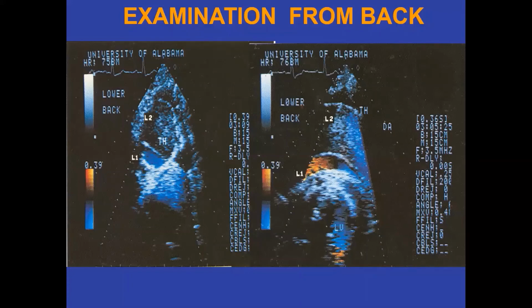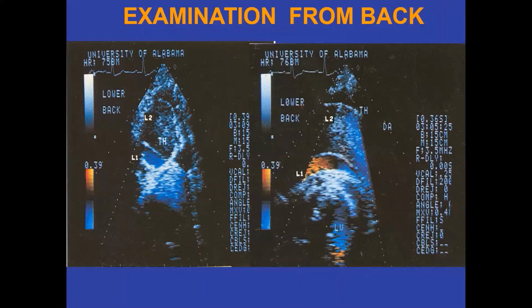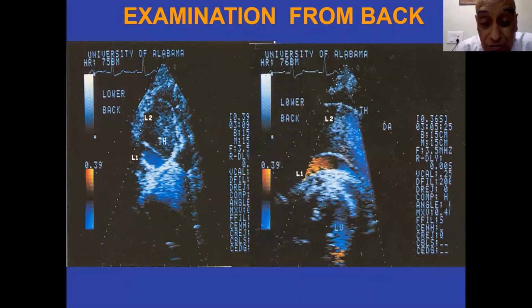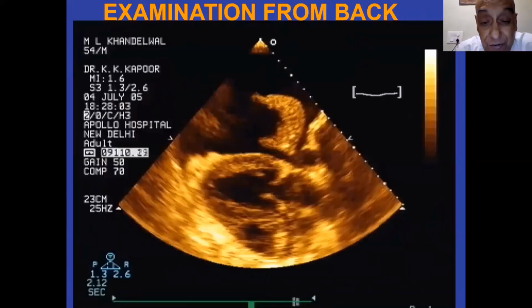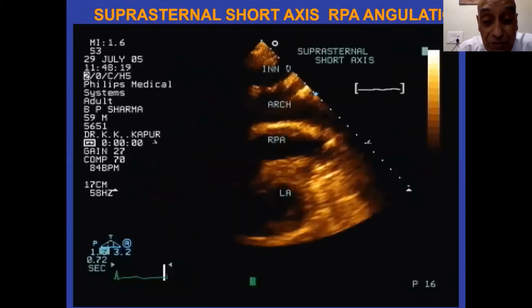Yeah. So when you're doing the parasternal long axis view, do you want me to show the image also, or you want me to just speak? You could do that, sir. People can see the image. Yeah, so I'll just go to that image. I'll show you the image again, because you might have missed it, because of course it was a rapid presentation.